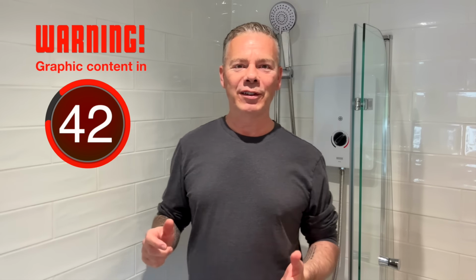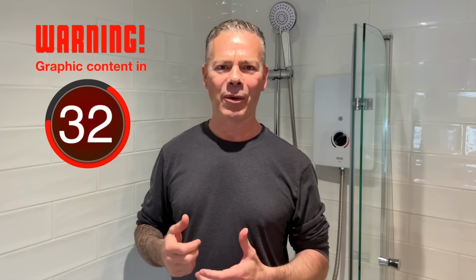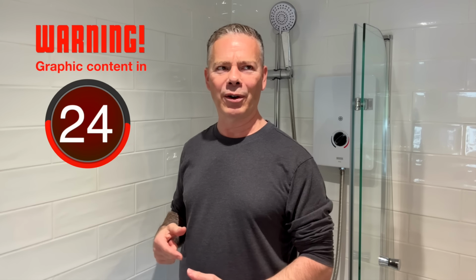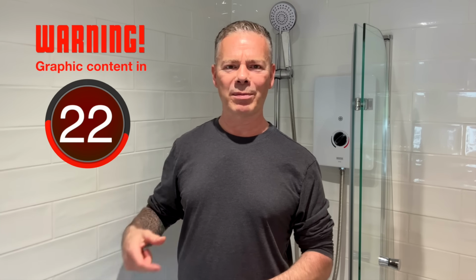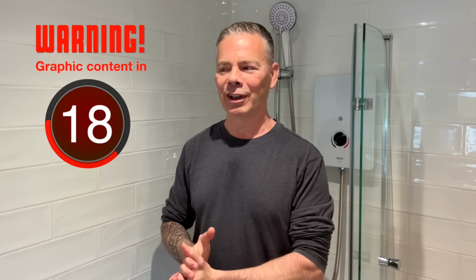So there's a few things that I've been told I have to do. First of all, find somewhere clean. So I'm in the bathtub by the shower, which has been scrubbed. It's a bit echoey in here, but anyway, this is where I am. The first thing I have to do is drink plenty of water before and after. So I had a cup of coffee when I got up. I've drunk about 2 glasses of water and I've got another glass ready to go afterwards.